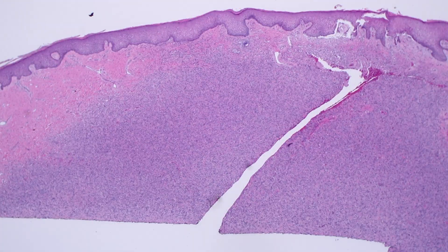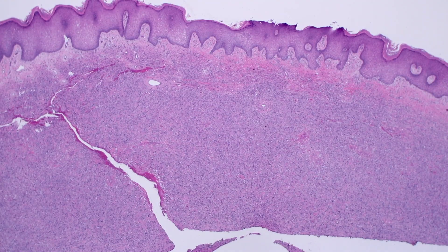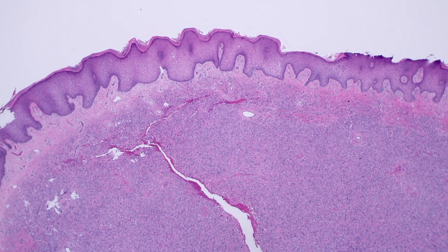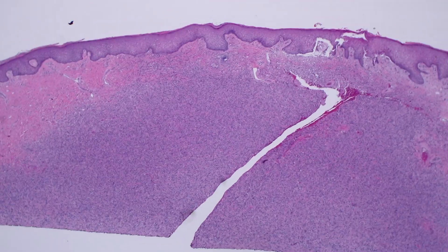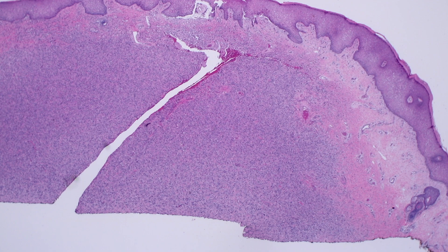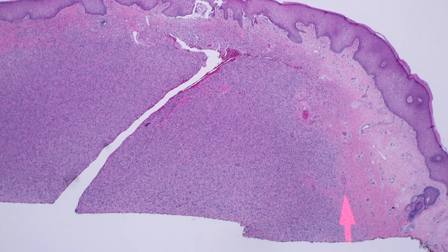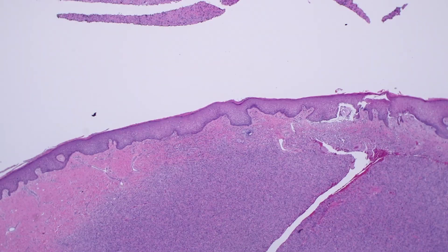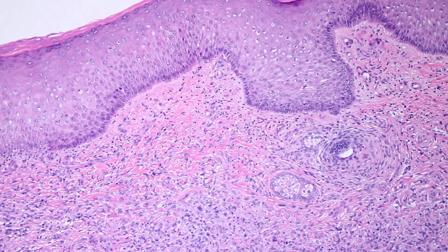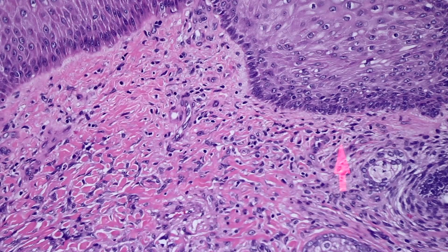Here's another variation of Dermatofibroma. Look very clearly from low power - you've got beautiful epidermal hyperplasia with that kind of flat-end tabling along the base, and you've got a cellular spindle cell proliferation in the dermis. There's a crack in the middle, just an artifact from cutting. The edges are a little fuzzy - the tumor is trickling in between collagen at the edges, which is a usual finding in Dermatofibroma. There's a little tiny bit of induction - you can see a little tiny basaloid island with some dense cellular stroma around it.